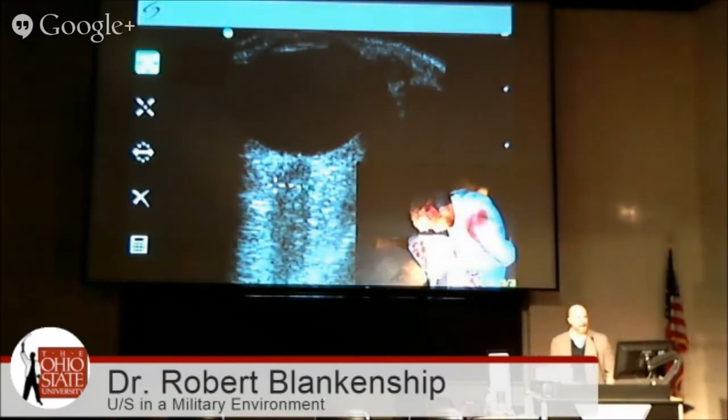How about this guy? You're probably saying, wow, I knew these military guys were hard, but this guy has an open head injury and they've got him with handcuffs on. Not true. He was minding his own business when two dudes rolled up and shot an RPG off. And they were so excited they didn't wait for the chamber to cool. They shot another one off. But unfortunately, if you don't let them cool, the round cooks off in the device. But with ultrasound, I don't have a CT, but I can look for an increase in intracranial pressure.